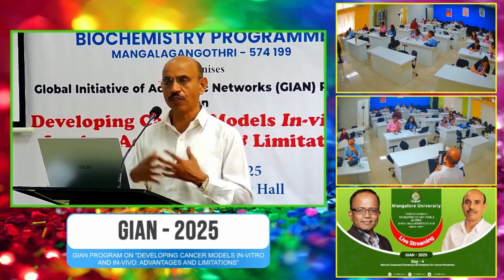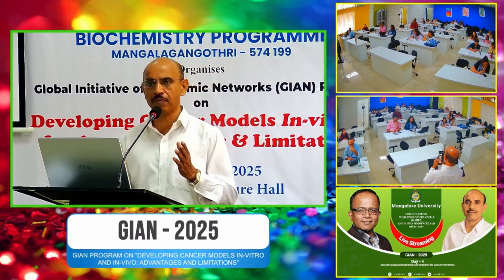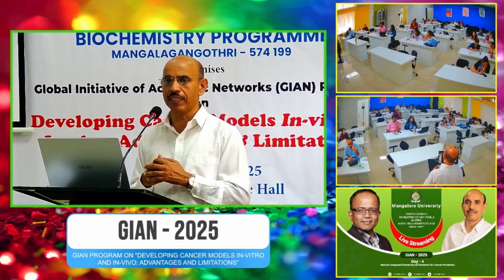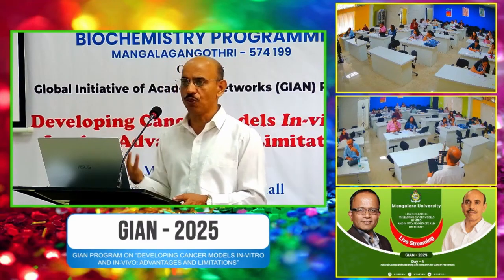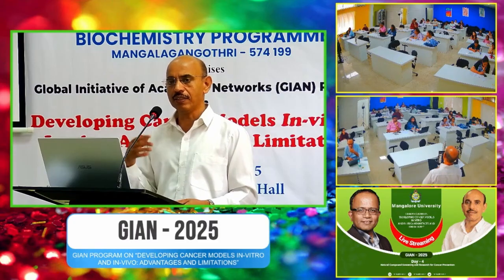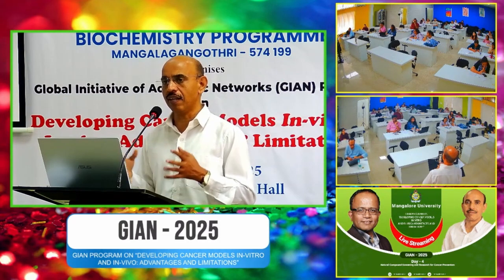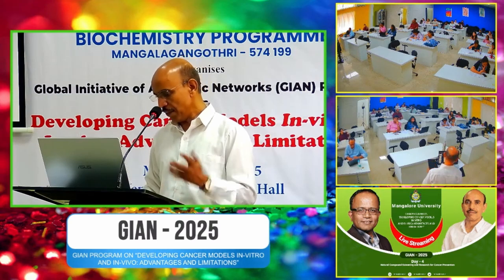But the thing is that there is a lot of chance of contamination, and nowadays, as many prepared medias are available from the suppliers, instead of wasting time on the preparation of the media, you can straight away purchase the prepared media which is already present in an aseptic condition, and you can use that one. It will be much easier. Or if you have the facility to prepare the media, that is fine.